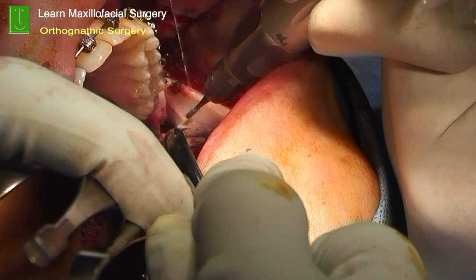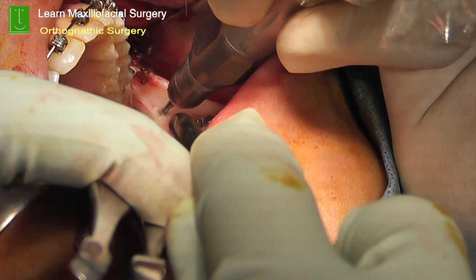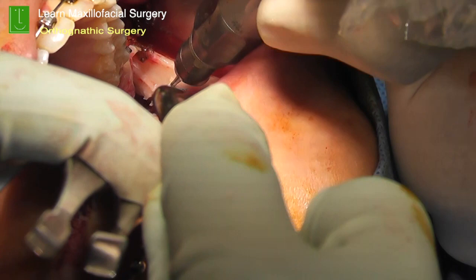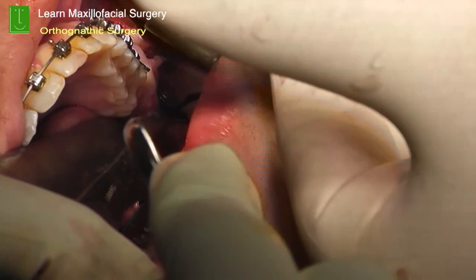Once you identify the lingula, then you make the lingual cuts, and that is what I'm doing. You can see the lingual cut just taking through the cortical bone. So this is the lingual cortical bone. Now, again, one of the tricks which I follow is, as we go laterally, don't just go horizontally, but start going slightly inferiorly. So there is a beautiful curvature, so that you're curving and joining the lingual cut to the vertical cut. See the way in which I'm now slightly inclining? That makes it much easier, and it prevents a splat. So a traumatic split, which many times can happen, can be prevented by giving that gentle roundness in the curve joining between the lingual cut and the vertical cut.